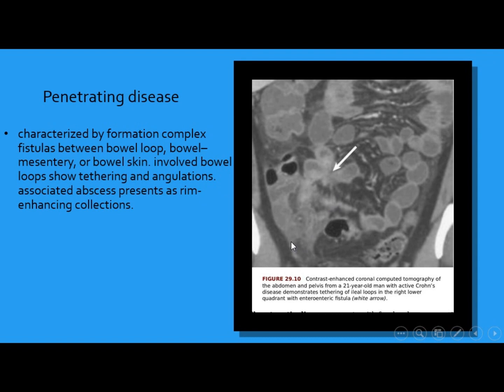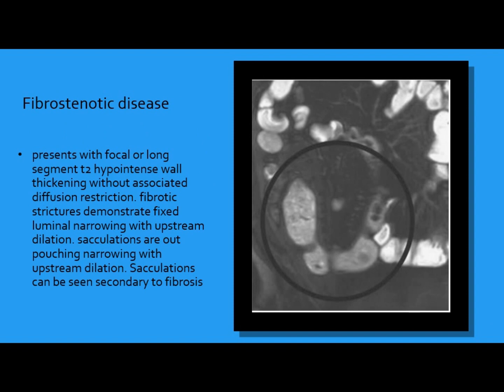On the penetrating phase, there is a sinus, and as mentioned, in the penetrating phase we can also develop abscess, which we can see on CT. This is a contrast CT of the abdomen and pelvis showing a sinus between the ileal loops — the ileal loops opening to each other. This is the fibrostenotic phase: it develops stricture and fibrosis with upstream dilation.